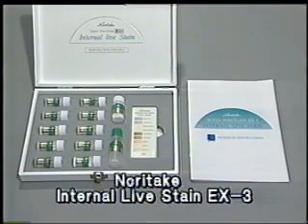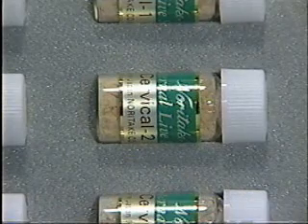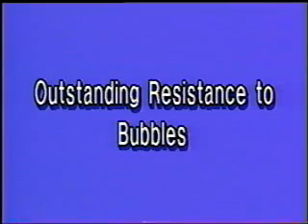Thus, we are led to focus our attention on the internal stain technique. To fulfill this technique, Noritake developed its internal live stain. Now let's look at the features of internal live stain. First, no bubbles occur. Previous stain may cause air bubbles during baking.